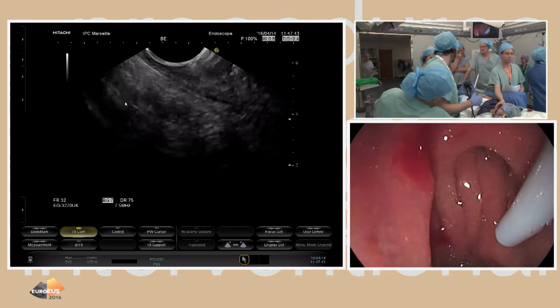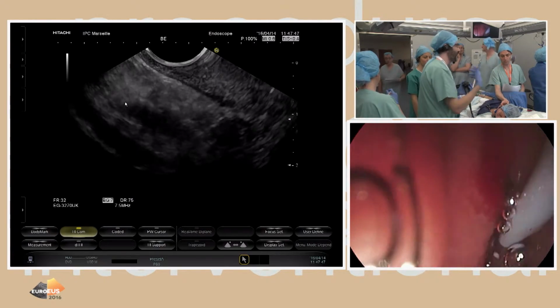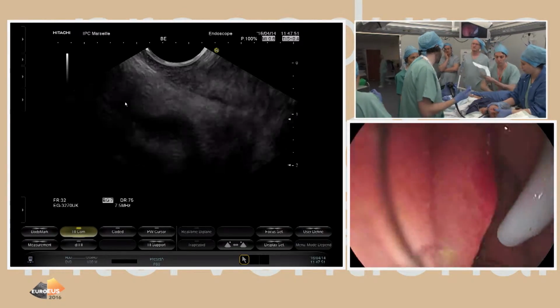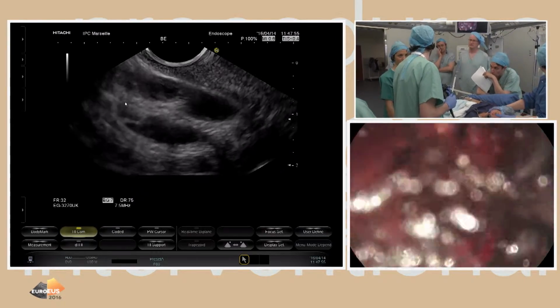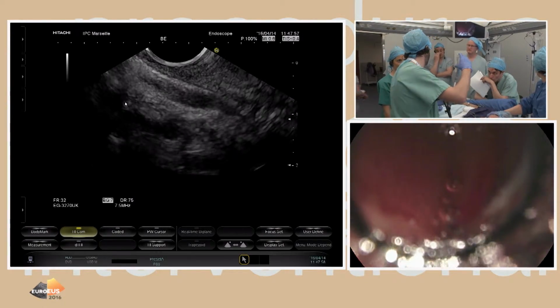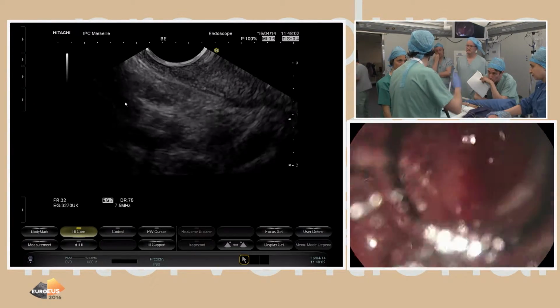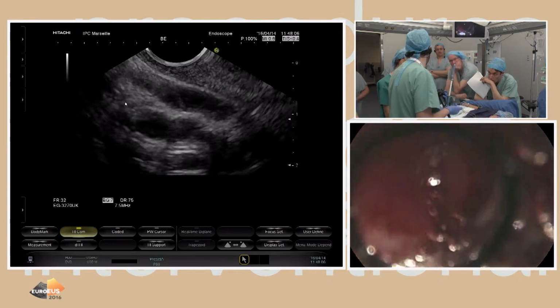But it's a very common question whether to use a stylet, yes or no, suction, yes or no, slow pull, yes or no. But all of the data in the literature, there is a very nice Japanese group that is the high suction group that they use 50 to 100 cc's of suction. And there's a specific group in Japan working in that line. But the results at the end, it doesn't change. The key point is to have a good pathologist.